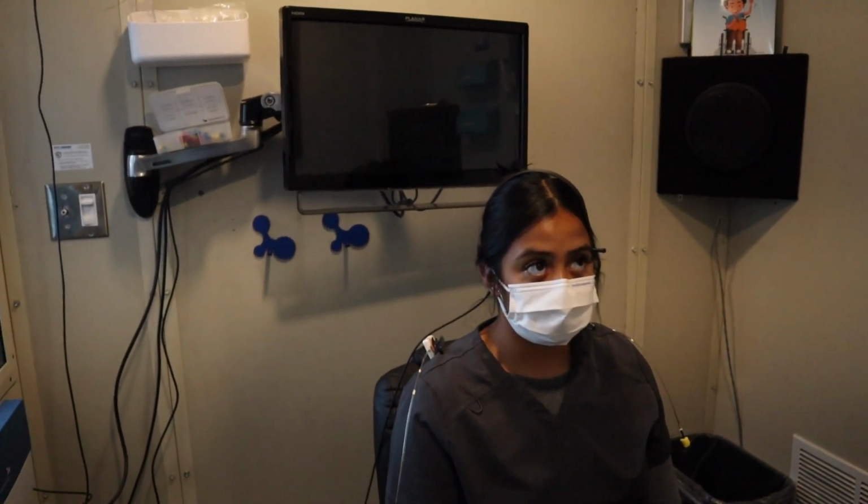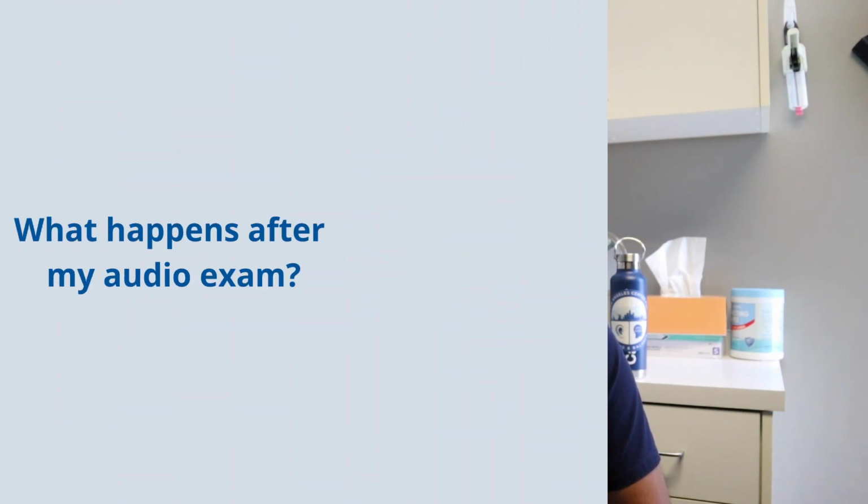While you're actively participating as the patient, there may be a time where your audio tester or audiologist is going to play some noise to block out your non-test ear. For example, if the bone oscillator is on your right side, we might need to put an insert headphone and play some wind noise to block out the left side so we can focus on what your right side is really doing. We'll always tell you what to expect, but oftentimes it sounds just like a wind noise or a static.